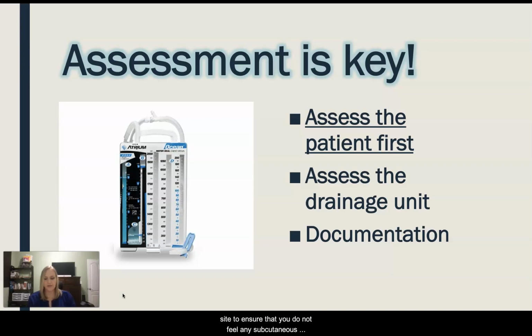Palpate around the insertion site to ensure that you do not feel any subcutaneous emphysema, or Rice Krispies popping underneath the skin. Ensure that the dressing is clean and dry, and if there is any drainage or soilage, you will want to change it.